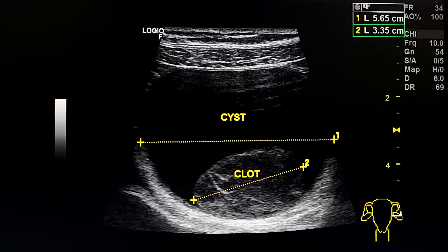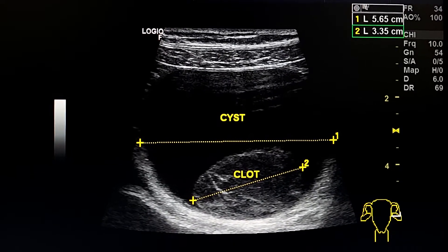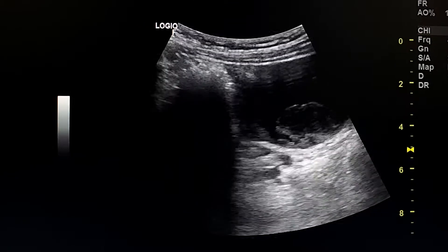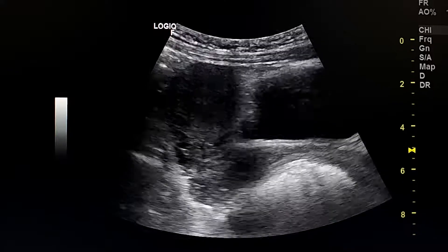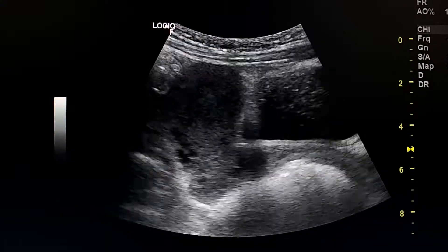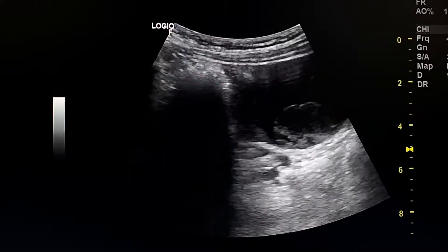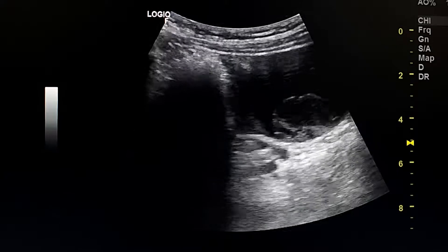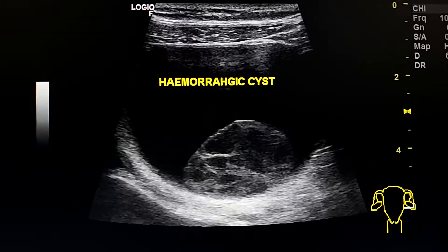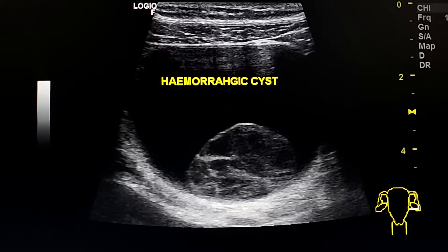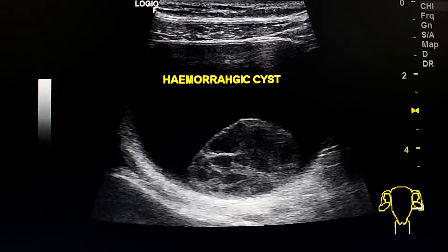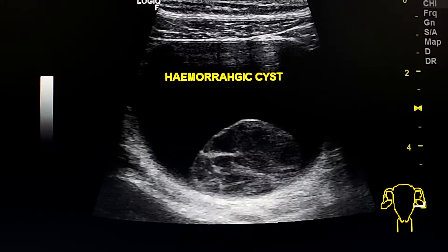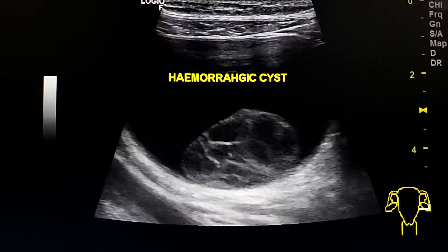It measures 5.6 centimeters and pushes the dome of the urinary bladder. This is a typical appearance of a hemorrhagic ovarian cyst.